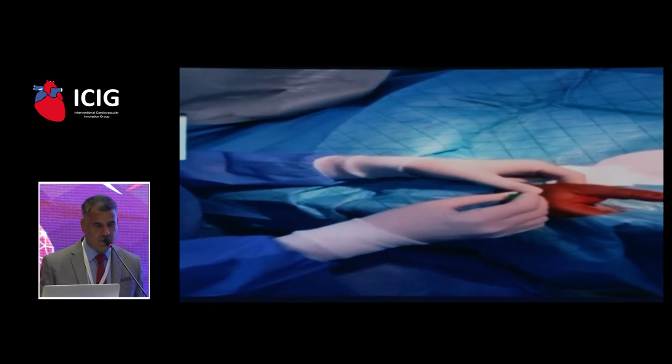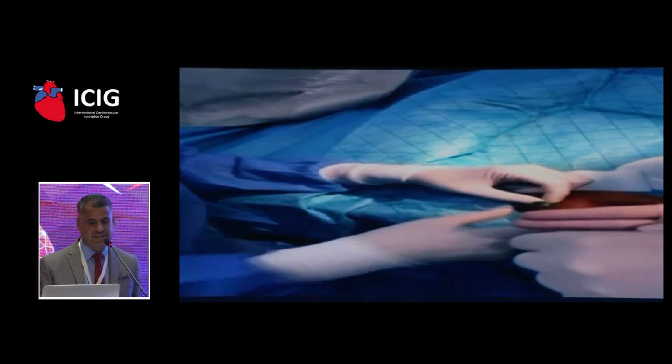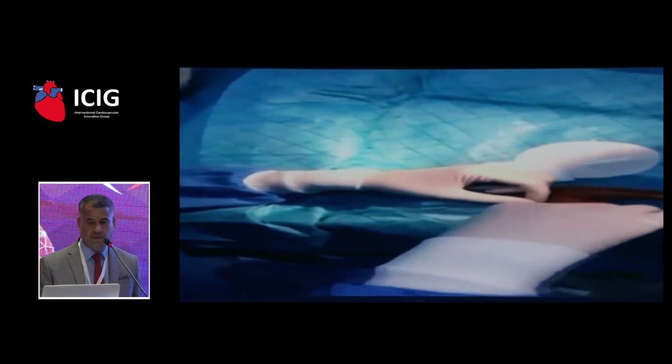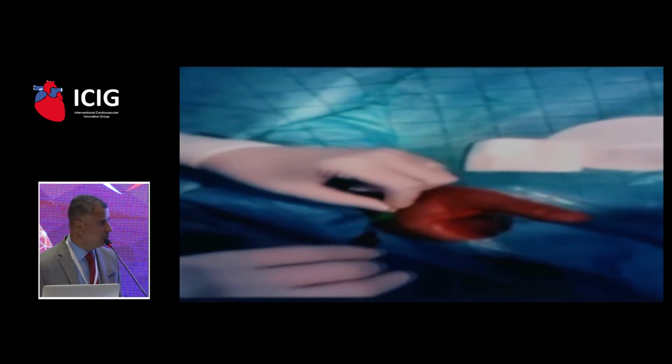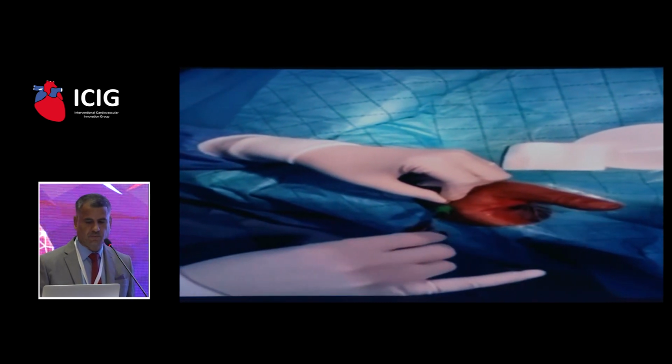This is to show how the procedure is done. To demonstrate the procedure, you can see. So this is the first puncture. This is the gush of distal radial. And we are using a Terumo sheath, because some manipulation is needed.